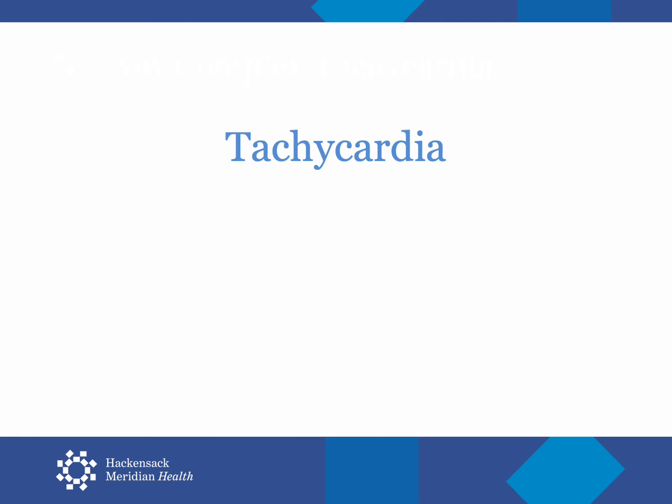Very rapid heartbeats can be the most threatening and, for the practitioner, among the most frightening cardiac events, so a systematic approach is needed.